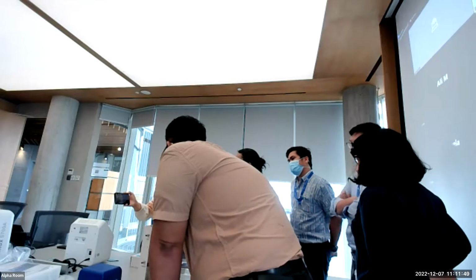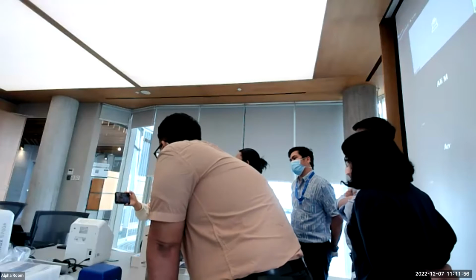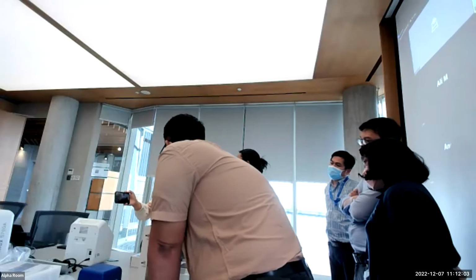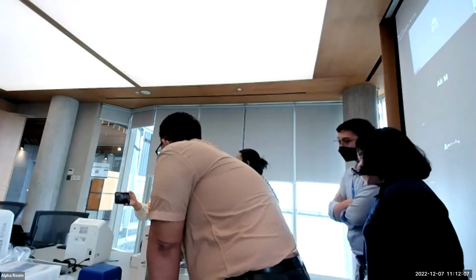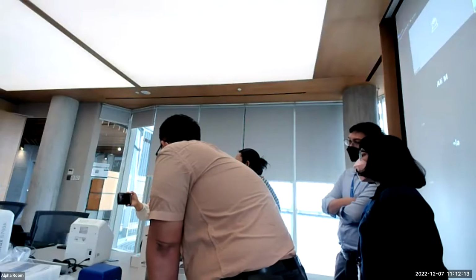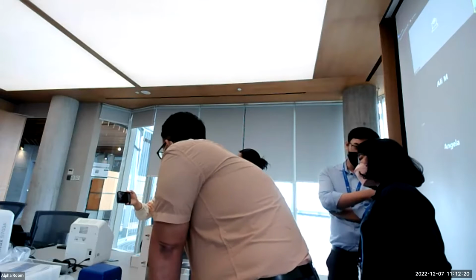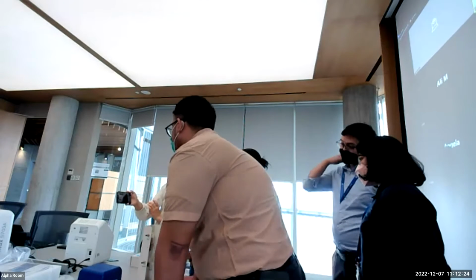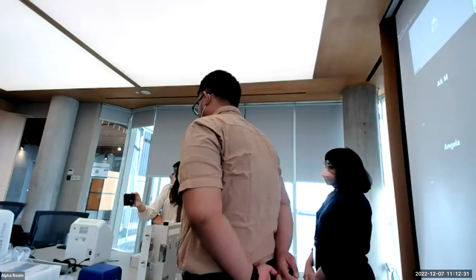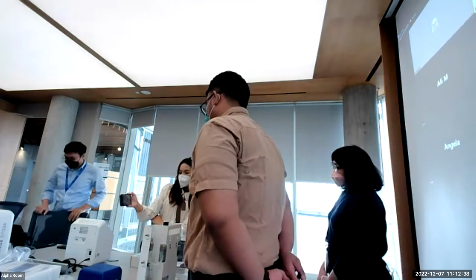And this tube here also has an inlet tube and an outlet tube. The outlet tube here will finally go back into our ventilator to test the air pressure. And out here, if you connect with the anesthesia machine, the outgoing air will be the anesthetic gas, so we need to connect this out to the canister. We have some adapters and pipes to help you connect this end to this end. They will finish the whole connection of the anesthesia machine and ventilator.